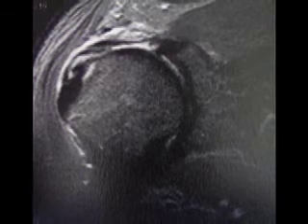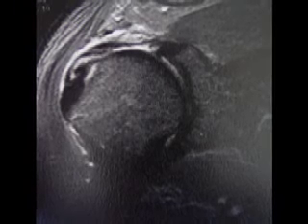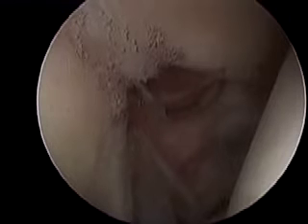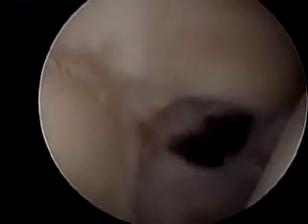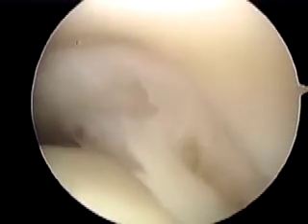And then finally an arthroscopy was indicated to evaluate and probably fix his rotator cuff partial tear and to perform a Mumford procedure too. So this is his arthroscopy. Now we are seeing a right shoulder. We're establishing the anterior portal using a spinal needle and then opening the capsule with a hemostat and a mosquito. Now we are palpating the biceps anchor. This is not a SLAP, just a degenerative condition. And his biceps, when we probed it, was in a very nice state too.